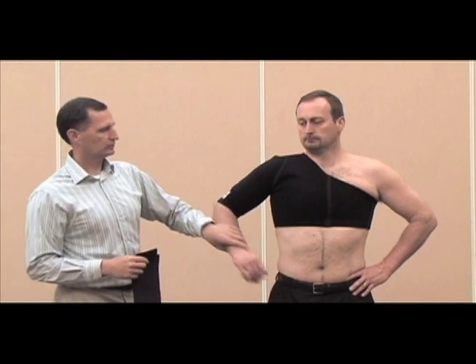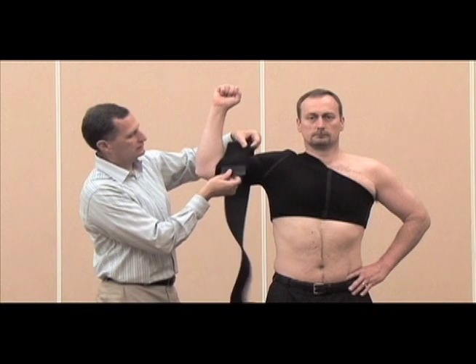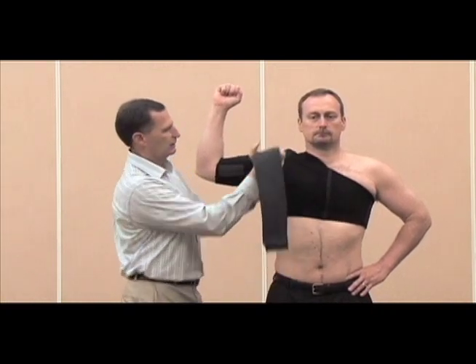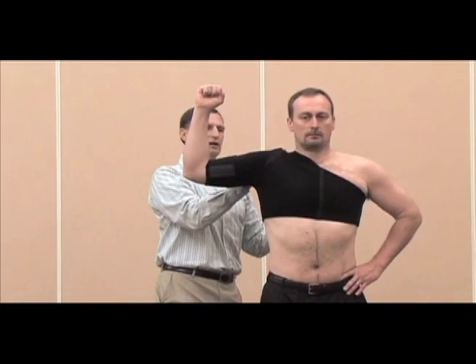The next application is for a potential rotator cuff strain. What we're going to do is try and assist the shoulder in performing external rotation. With the arm abducted to 90 degrees, start the strap just before the bicep and across, following the same path the rotator cuff would take.